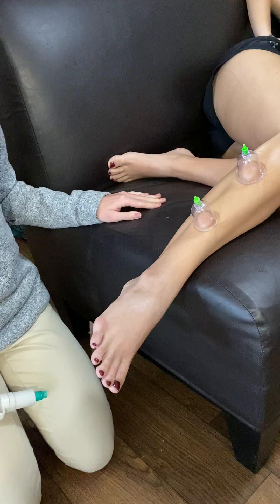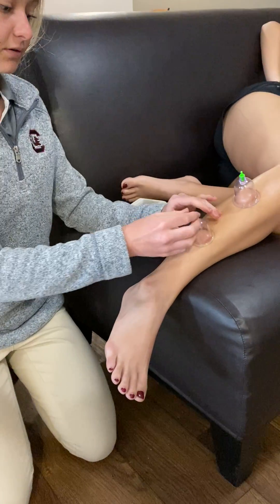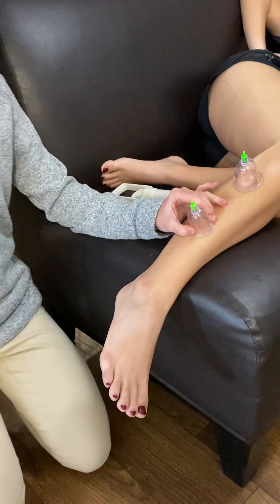Keep going nice and slow. We're going to do this for about 10 minutes, and then afterwards we can pull here to release the suction from the cups.